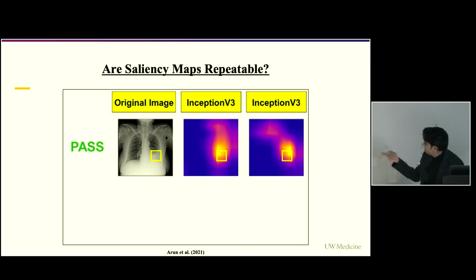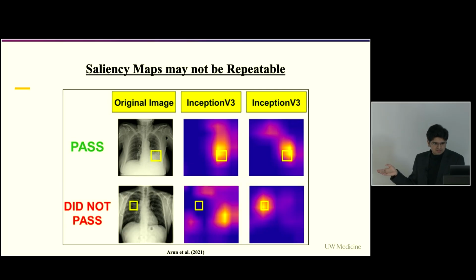And we see that maybe in this case they do. So the sanity check has passed. The models are doing well. They are learning the right set of features. But how about this? The same two models now pick up on different things in a different scenario. Unfortunately, most of these saliency methods work well in ideal scenarios, the ones that we do not usually see in clinical settings.